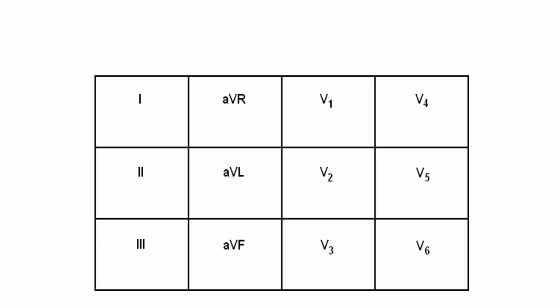So in an ECG, you'll get the groupings of your ECG. You'll get your lead 1, your lead 2, your lead 3. In that progression, lead AVR, lead AVL, lead AVF. This is how your ECG will follow in terms of the tracing on your ECG paper. Then V1, V2, V3, V4, V5, V6. Because today it's an introduction, we might not delve into it much, but we'll have another time to delve into the groupings of these leads.